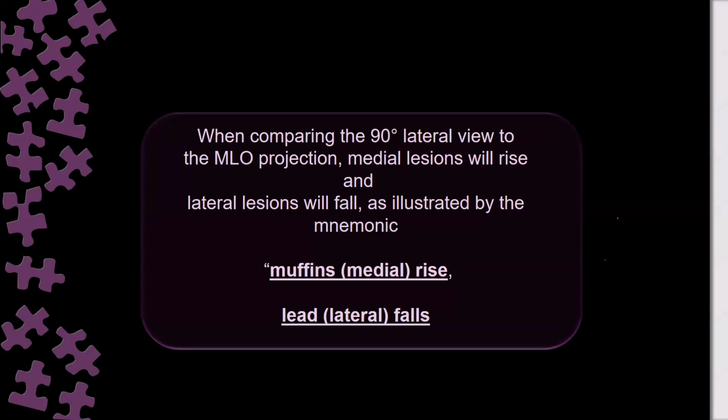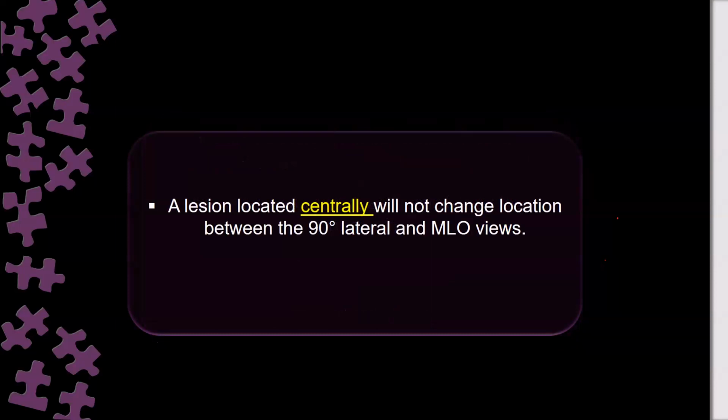We compare the lesion on the 90 degree lateral to the MLO. If it is raised, it is medial, because muffins rise, and M is for medial. If it falls, it is lateral, because lead is heavy, it will fall. Okay? What about the central locations?